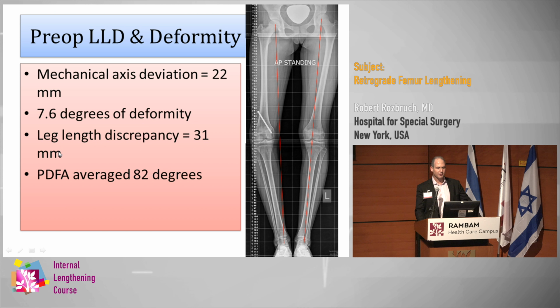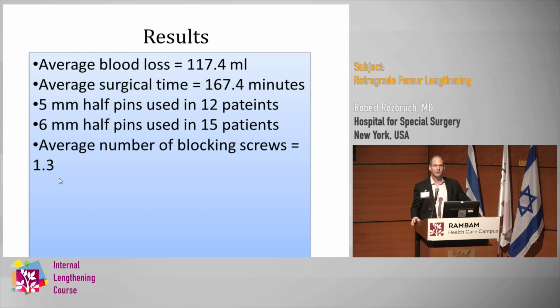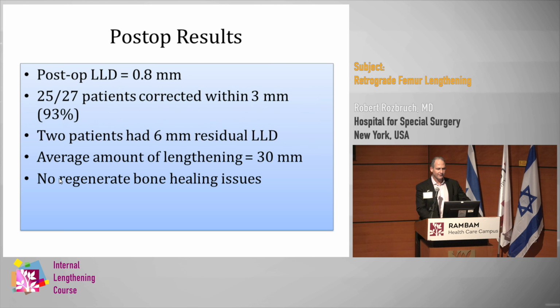When we did the fixator assistance, some cases had 5 millimeter pins, some cases had 6 millimeter pins, and the reason we're making a distinction between that is that we tried to show that it had some kind of an impact on the ability to accurately correct the deformity. The average number of blocking screws was 1.3, and the latency phase was 5 days.